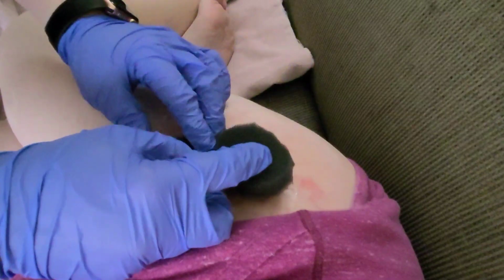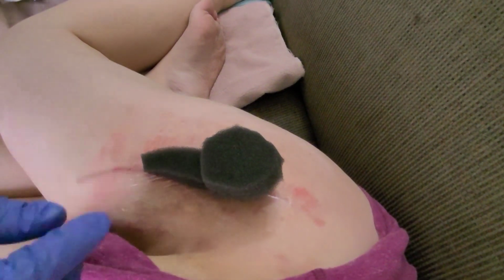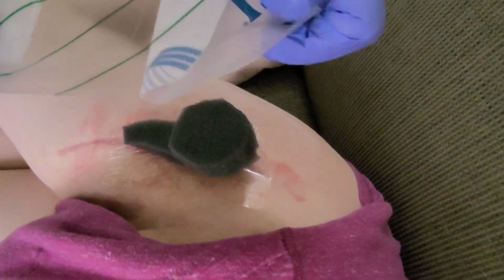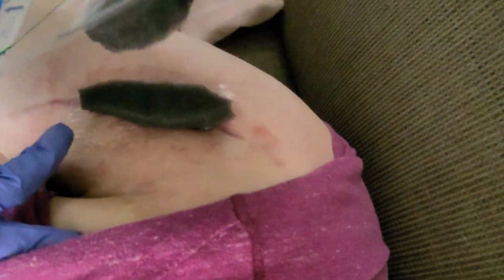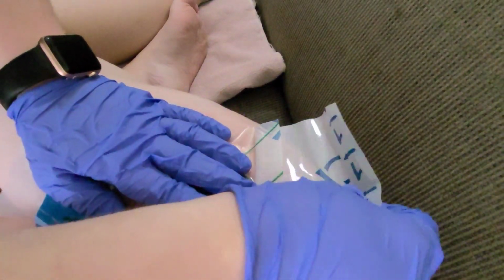Then she starts laying the other pieces of foam on top of that, which is kind of tricky because she has to balance it somewhat, because then she's going to put one giant piece of the tape stuff, I can't remember what it's called, down over the entire thing so that it's completely airtight. That way we get a nice vacuum seal.